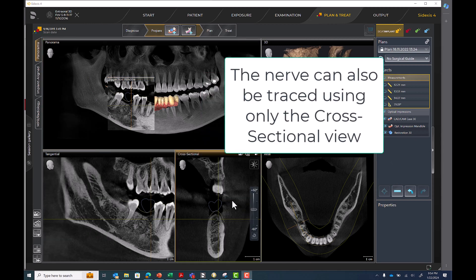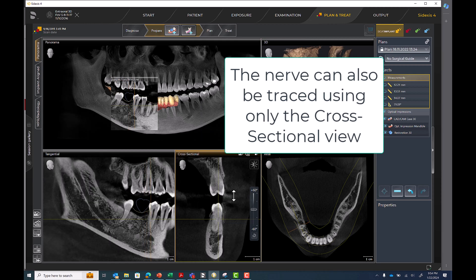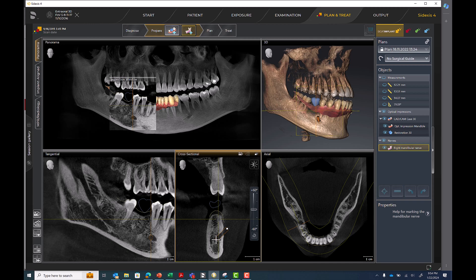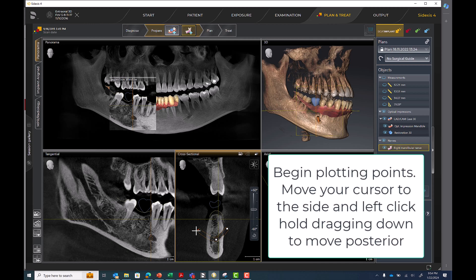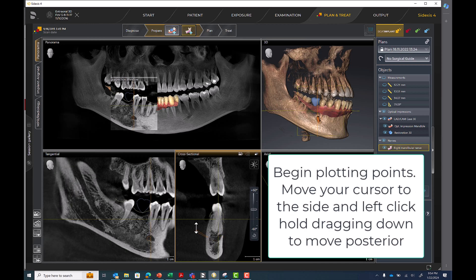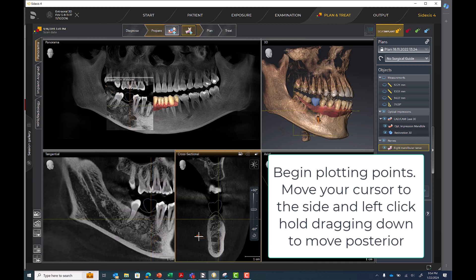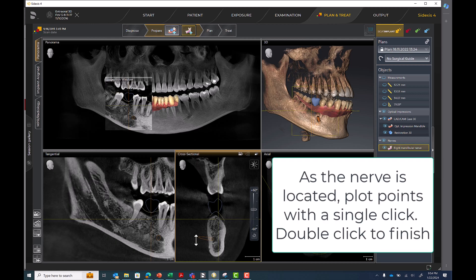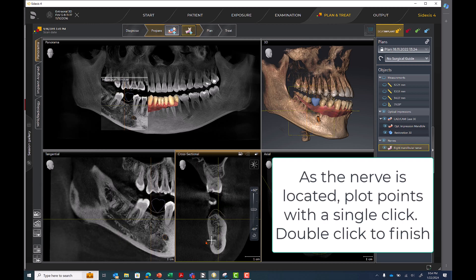The nerve can also be traced using only the cross-sectional view. In the cross-sectional view, locate the mental foramen, then select Mark Mandibular Nerve. Begin plotting points. Move your cursor to the side and left-click hold dragging down to move posterior. As the nerve is located, plot points with a single click. Double-click to finish.